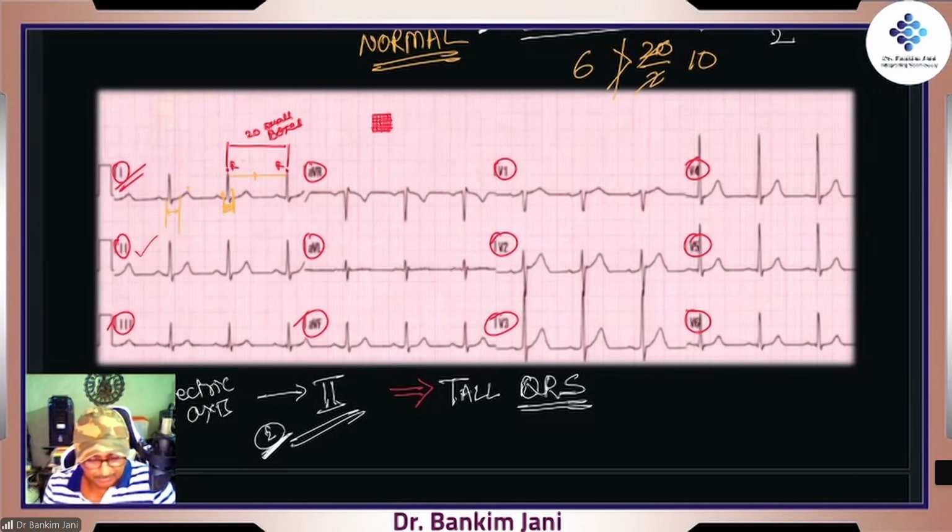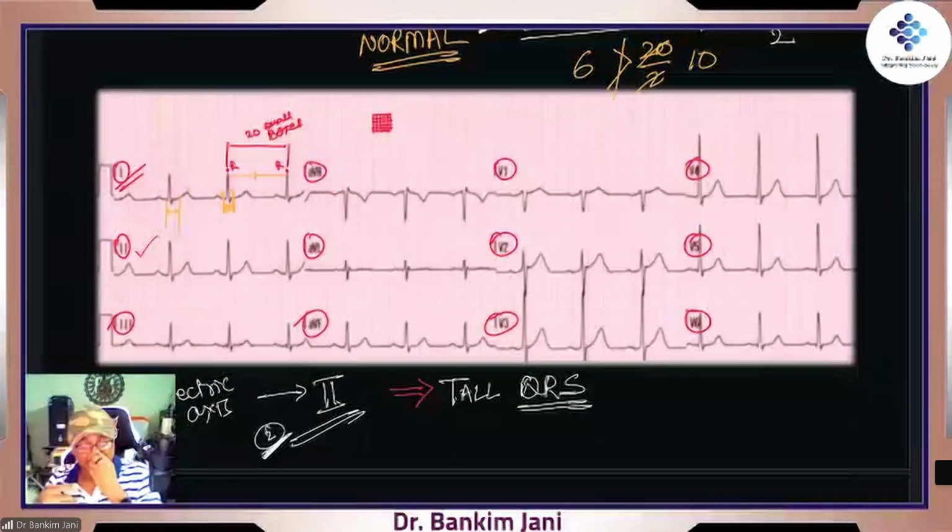Now we are talking about the chest leads, V1, V2, V3, V4, V5, V6. Which leads will have the maximum voltage? The leads which are watching the left ventricle.